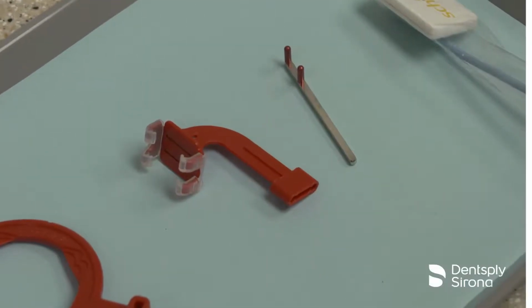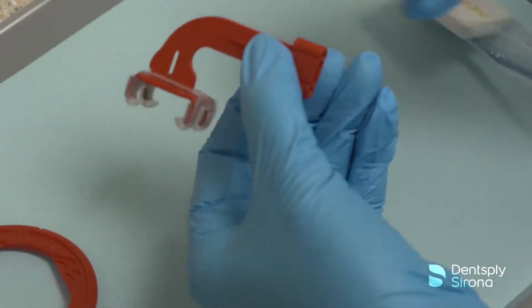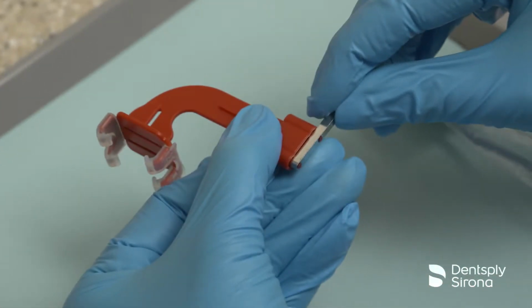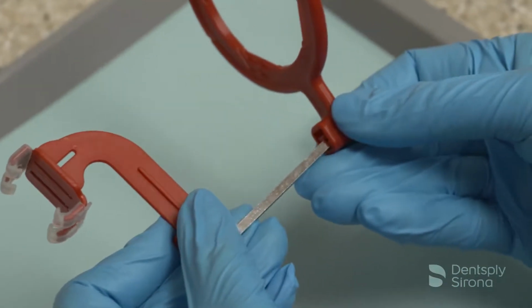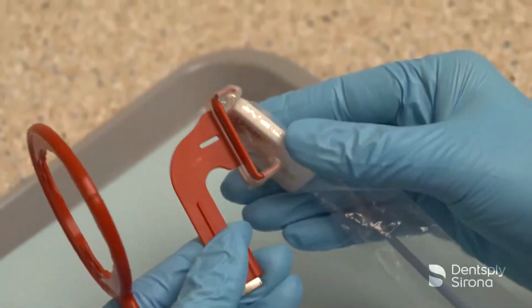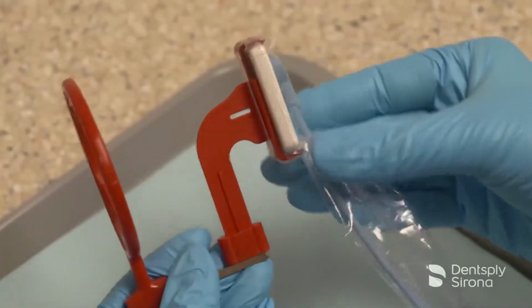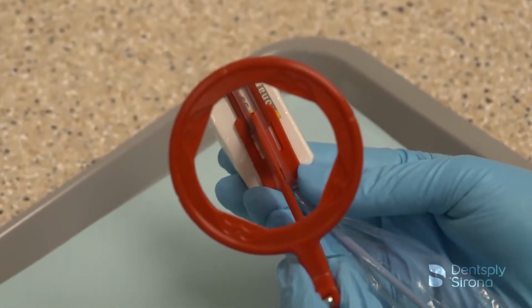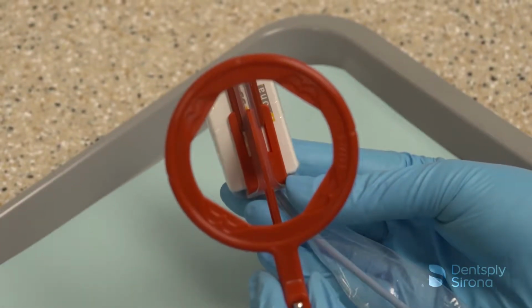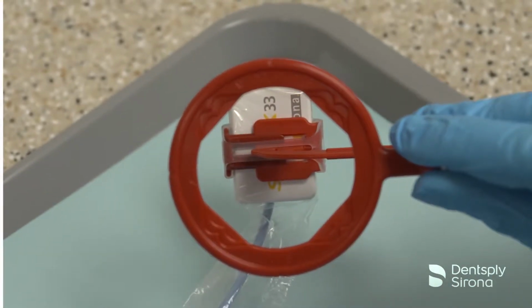To assemble the XCP Short Arm with the XCP DS Fit Bite-Wing Bite Block for images, place the red pins on the arm into the side of the red bite block and slide the arm into the red aiming ring. Securely insert the sensor into the red bite block, making sure that the active side of the sensor is against the flat surface of the bite block. If taking horizontal images, the sensor will be placed into the bite block in the horizontal position and in a vertical position if capturing vertical bite wings.